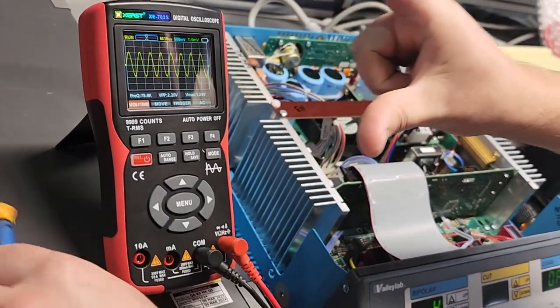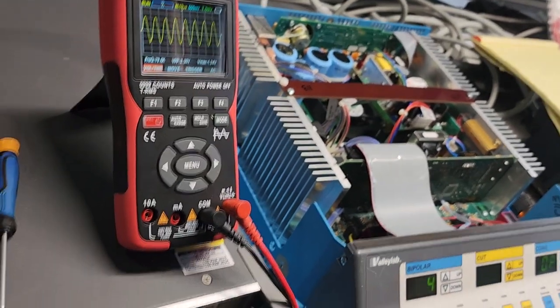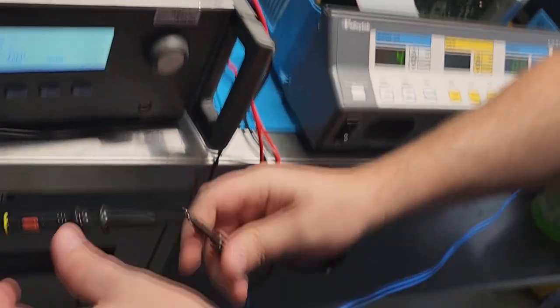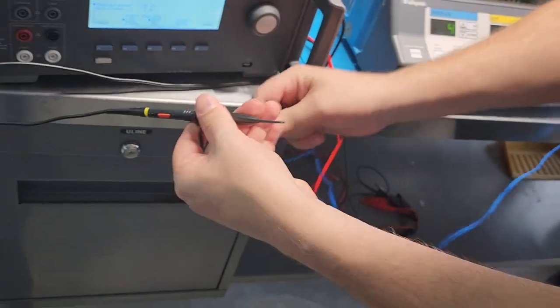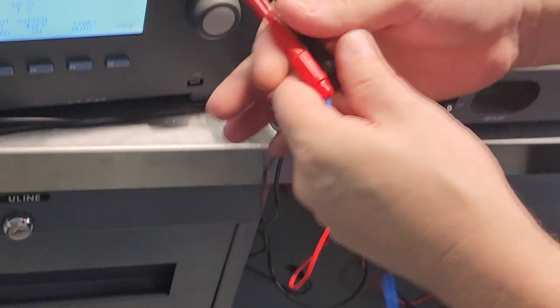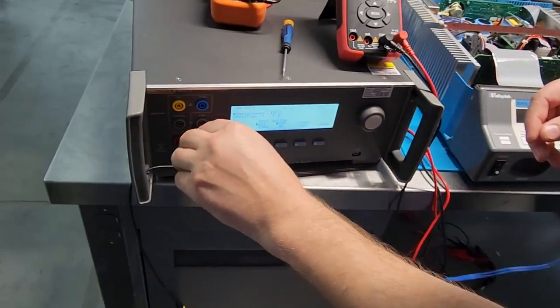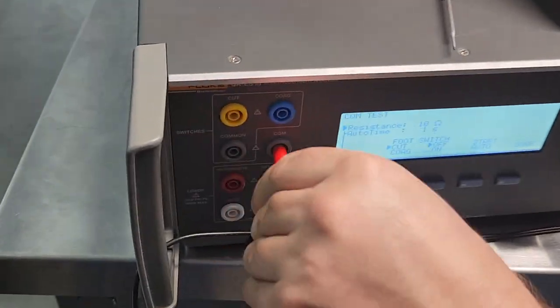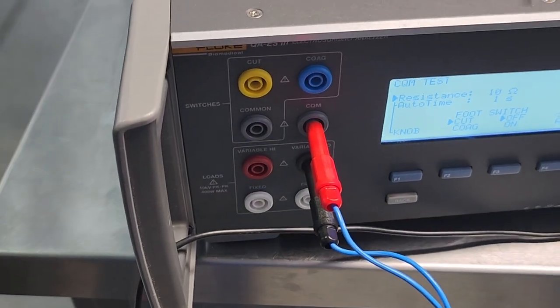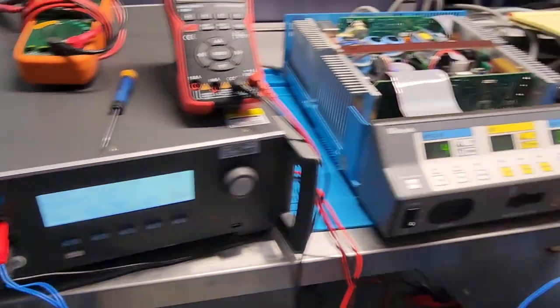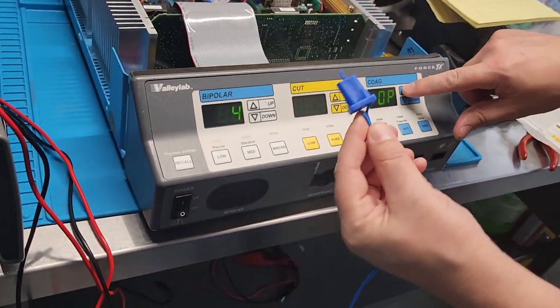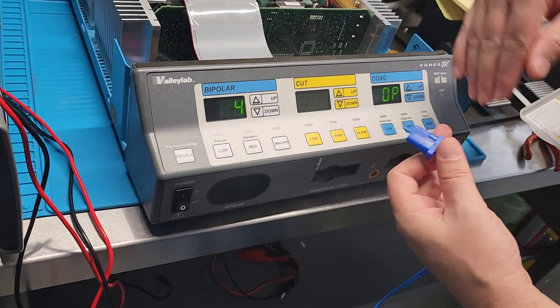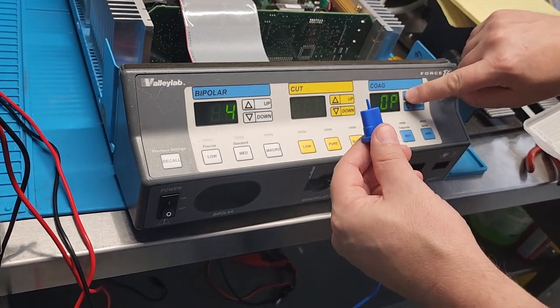So the wave's not getting any bigger. Now we can disconnect these guys. That is all we have to do for the oscilloscope. Now we're going to hook this guy up to our CQM. And this is open. So I'm going to pull the plug. We're going to set the values for an open circuit.